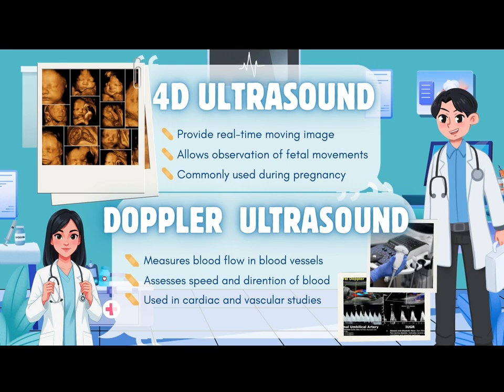Moving on to 4D ultrasound. 4D ultrasound is similar to 3D ultrasound, but it includes real-time movement. Doctors can observe fetal movement such as hand or facial movement during pregnancy. It is helpful in monitoring fetal development and assessing overall well-being.